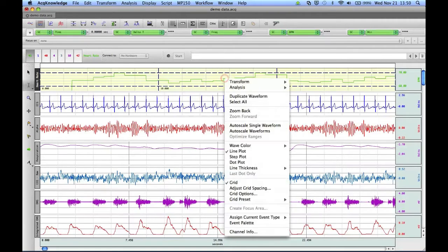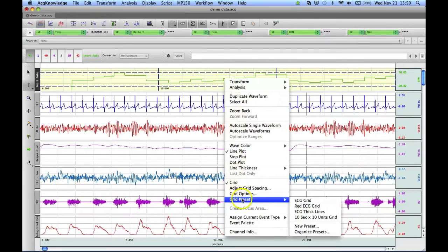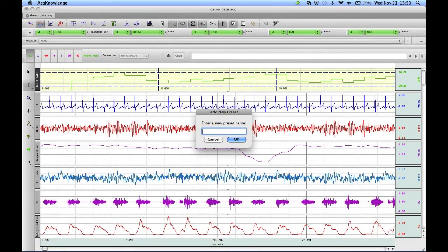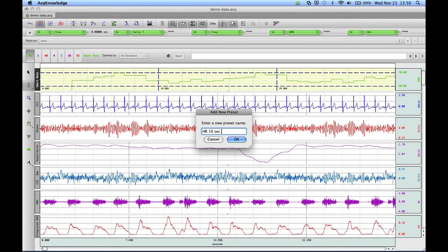To do this, you right-click, scroll down to Grid Preset, select New Preset, and then you can enter a descriptive name. So I would call this heart rate 10 seconds 60 to 70, and click on OK.